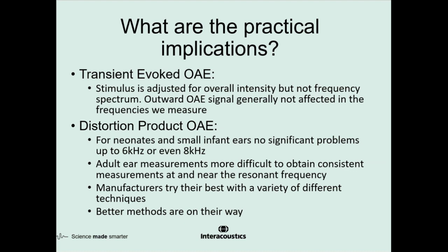And the main thing to be aware of is that if you are performing a repeat measurement, so if you're monitoring for noise-induced hearing loss over time or ototoxic medication, etc., the main thing is to ensure that the fit is repeatable between measurements. So again, if you have a patient come back in after 3 months, pull up the old notes, have a look at the probe fit, and just try and reproduce that fit when you insert the probe, so that at least we're controlling for one of the variables if we can.